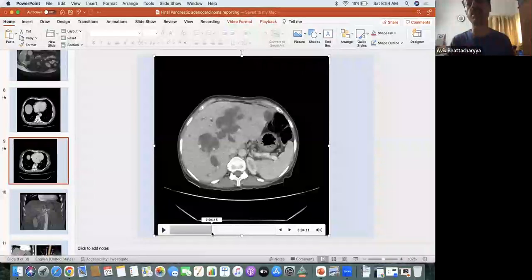When you are talking about a pancreatic or hepatic lesion, you see a few focal nodules in the lung, so again it is inoperable. You go through the HRCT, and you say this may be the end-on view of the vessels. So when you see it on the console, your 80% job is done, but the rest 20% would be solved by your radiologist friend.